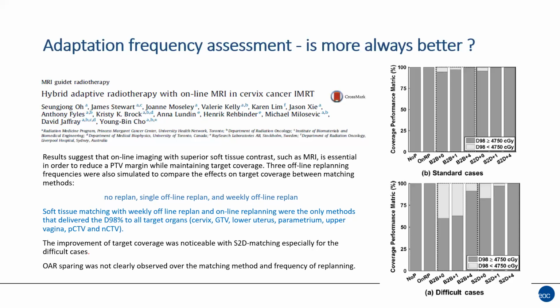And also because we are a center that has an MRI-only workflow, this could be a potential solution for us to have rescans for cervix patients as standard. So maybe we can schedule this and do it as a routine type of treatment to adapt more.